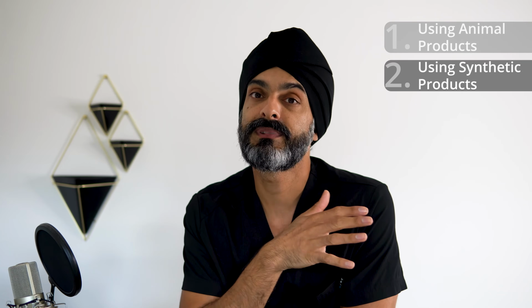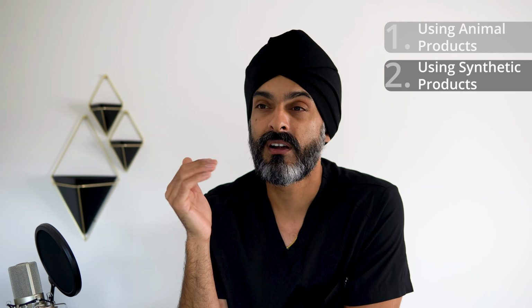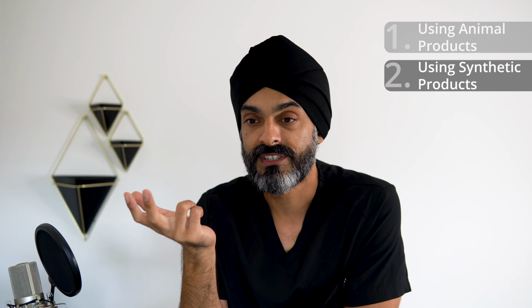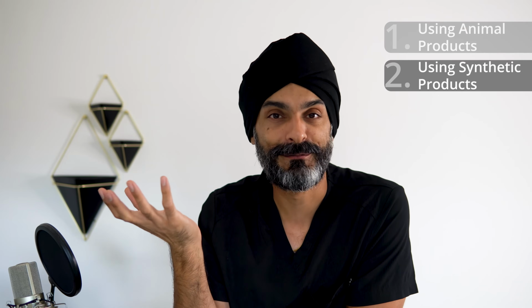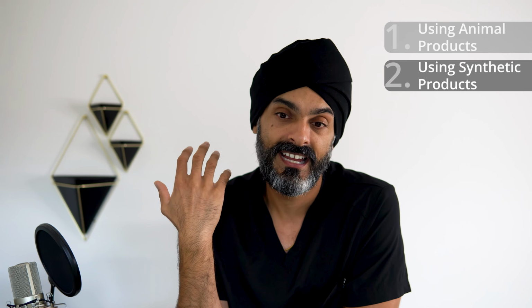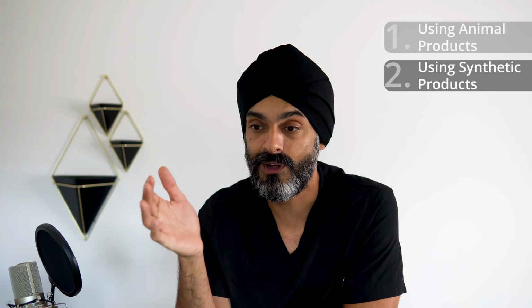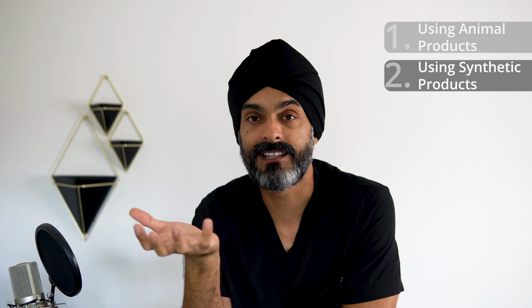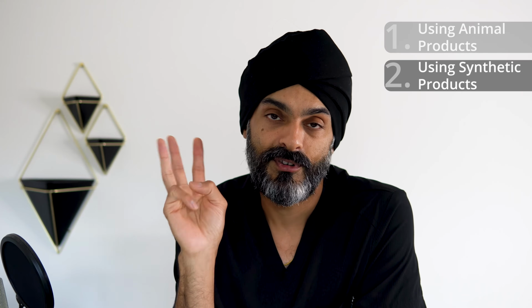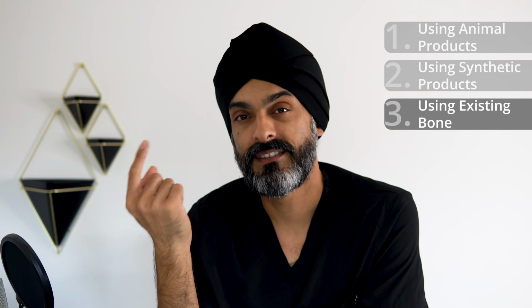I think it's going to be very similar to using the animal product, but a lot of people are not 100% comfortable, maybe for religious or ethical reasons, or just knowing that they've got some other human's bone inside their head. Okay, for some people, this is really, really important, and we can't ignore it. So these synthetic products are promising a lot, and I really hope that they work, because it would be a really neat alternative. Now, the third type of bone grafting is the least common, but it's probably the best type.